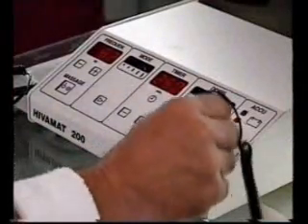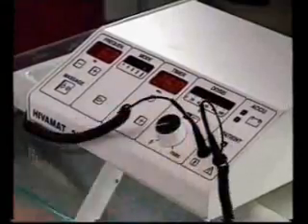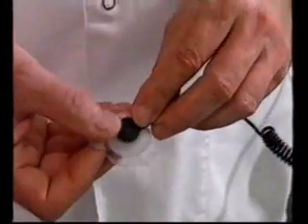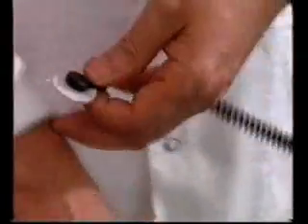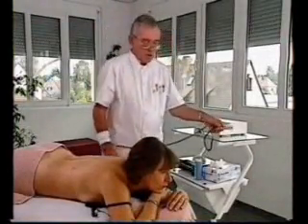For treatment, both therapist and patient are connected to the unit. The therapist by an adhesive pad stuck on a piece of plastic foil and attached to the arm under an armband. The patient by the neutral bar.